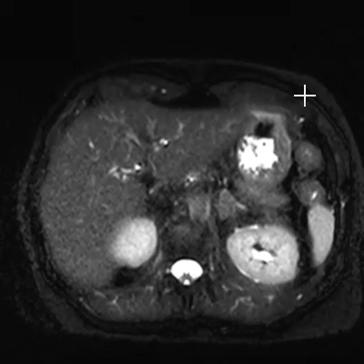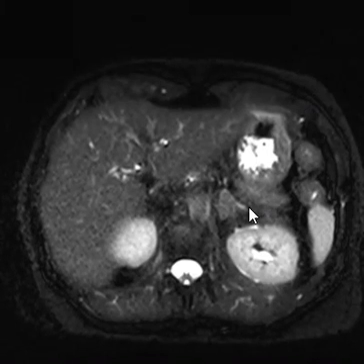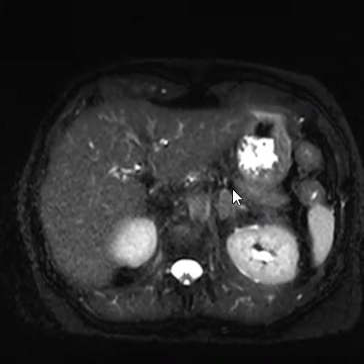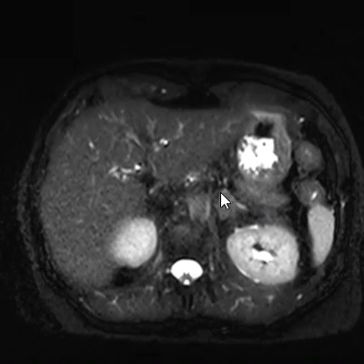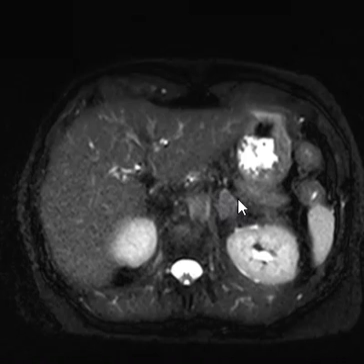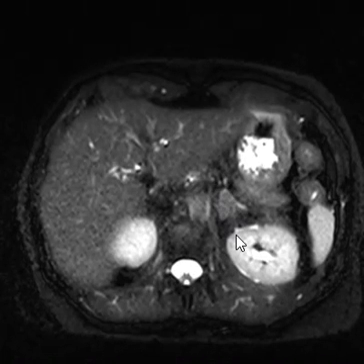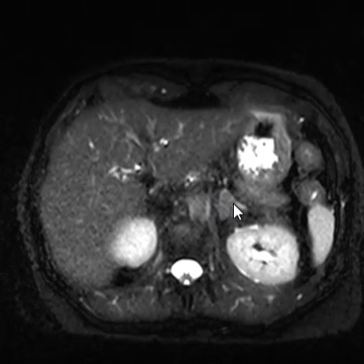An MRI was done here to see if it was an adenoma or not, and we do see the lesion right over here. It's about 2.1 centimeters by 1.7 centimeters. Here's the left kidney and left adrenal gland.